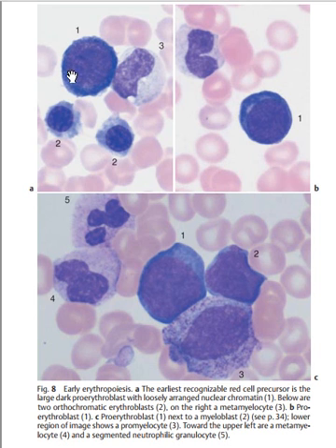These are the pro-erythroblasts here, and they are arranged with nuclear chromatin inside. You see, there's a very large nucleus here, so it tells you that it is the earliest form of the erythroblast, which is the pro-erythroblast. Is it clear? Below are two orthochromic erythroblasts. After the pro-erythroblast, you have the orthochromic erythroblast, which comes later.